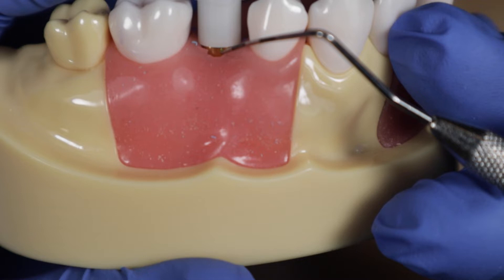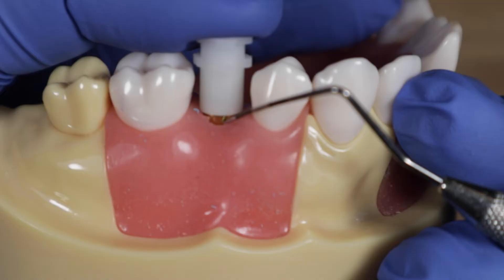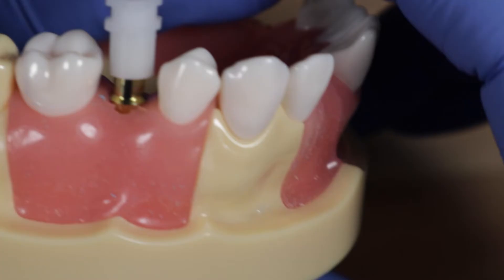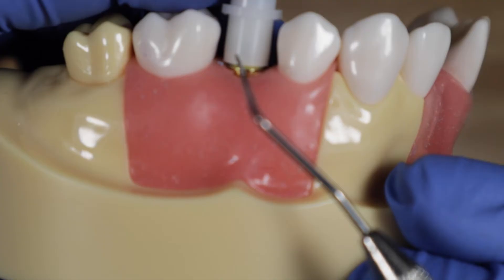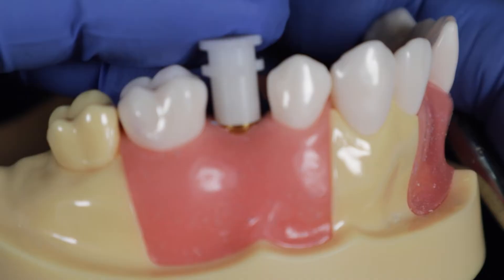Visually confirm it's seated — the margin of the impression coping should be flush with the white cap, and you can verify with a perio probe. It's critical to line these up. If you force it down at the wrong orientation, it won't feel like it seats properly and you'll see a gap at the margin. Take it out, put it at the right orientation, and seat it all the way down so those surfaces are flush.